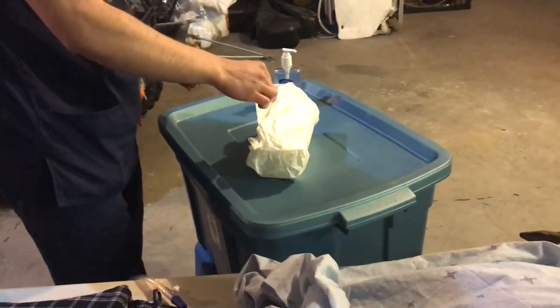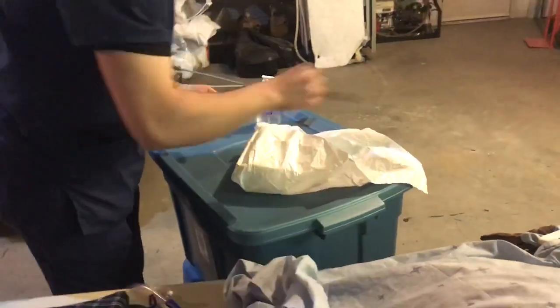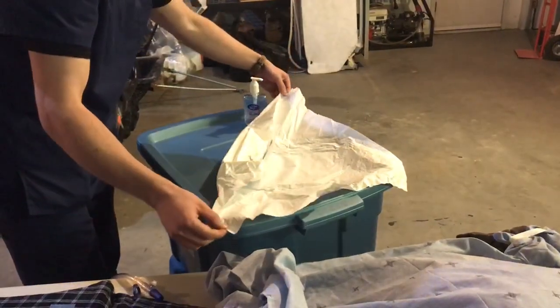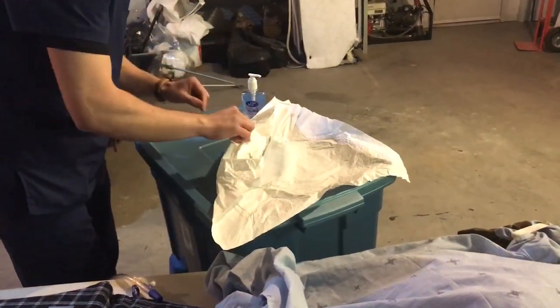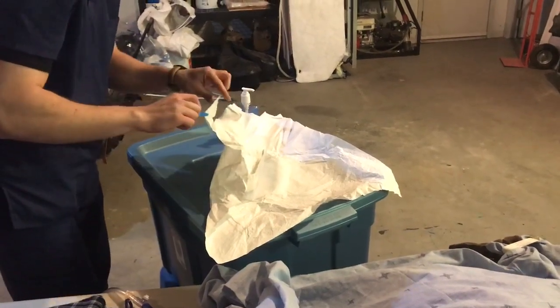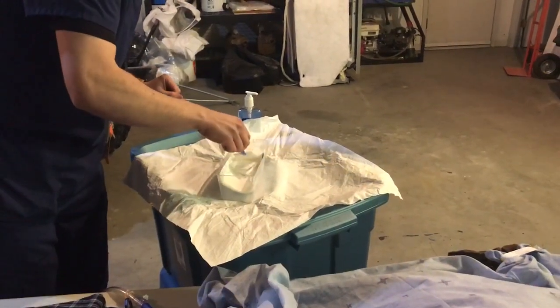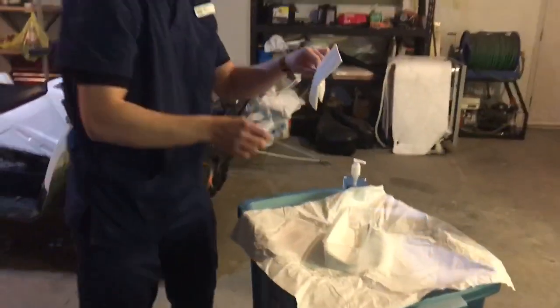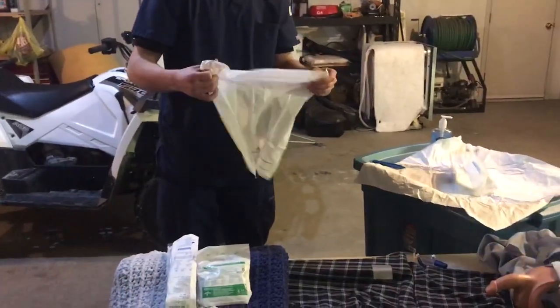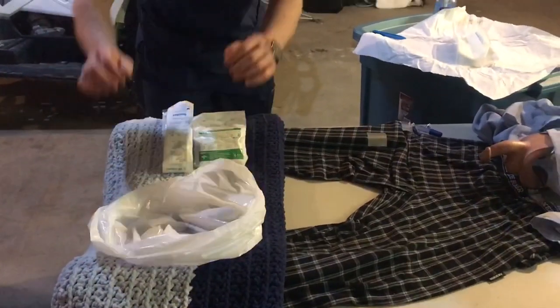Then I will, holding in the 1-inch border, open the first side, the second, and then the other side. And I will get my forceps, grab the 1-inch border there, pull that one. Now I'm going to pass my garbage bag to me. I'm going to open the garbage bag up and place that at the patient's feet.